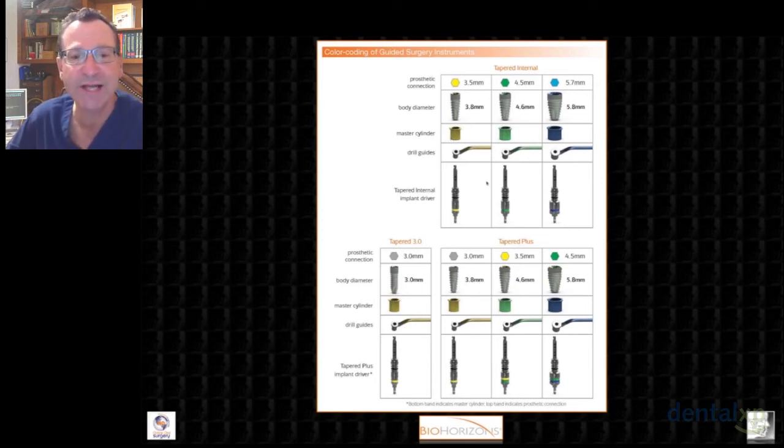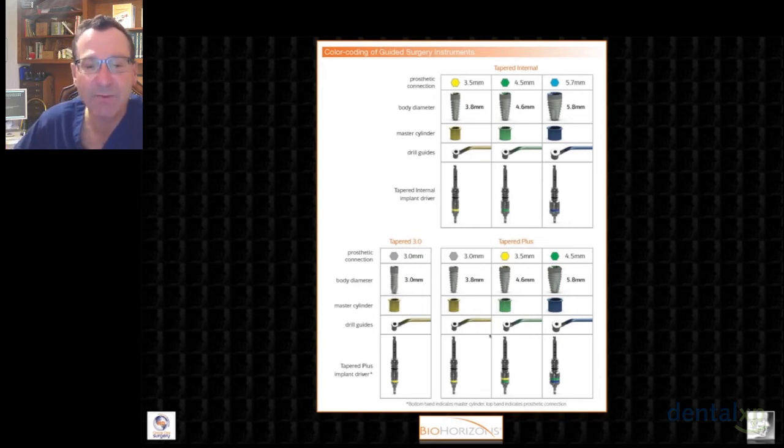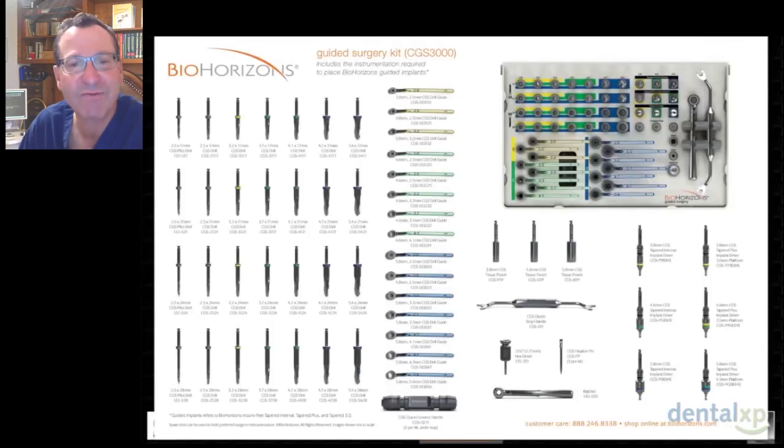Because the tapered plus is platform switched, we have a driver that's different than the tapered internal driver, because the implant itself has a smaller platform.